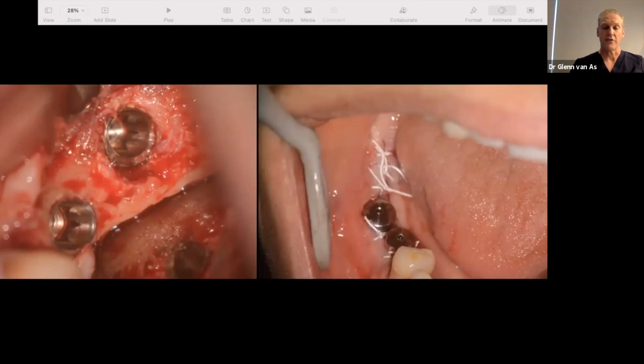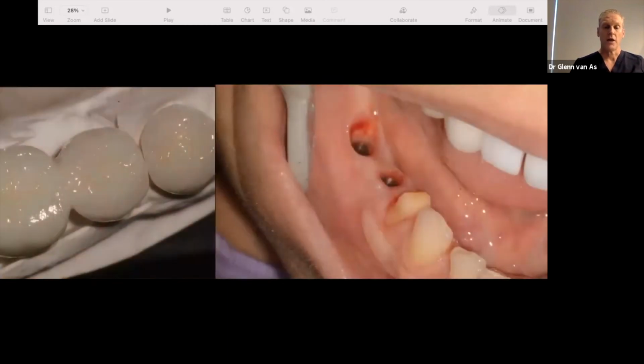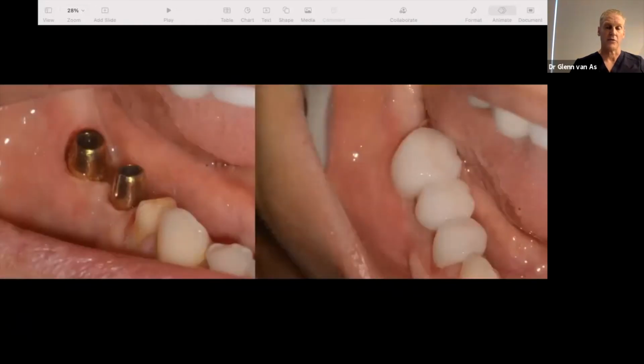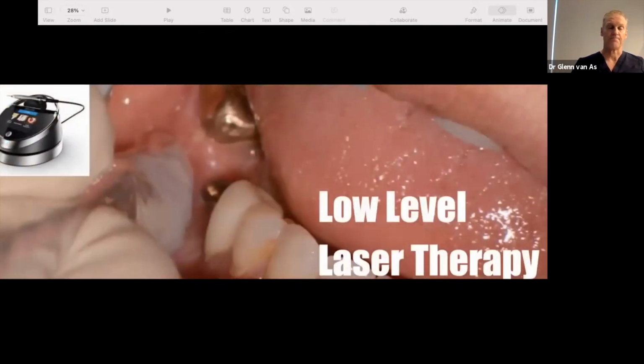This is an older case, probably do it differently now, but we did a crown on the anterior, and she wanted the 2 back ones, no screw holes. She wanted them cemented, so we put stock abutments in, and we had them glued over in a pearly white shade that David would be proud of. So you can see the final result there, and enough attached tissue for the case.